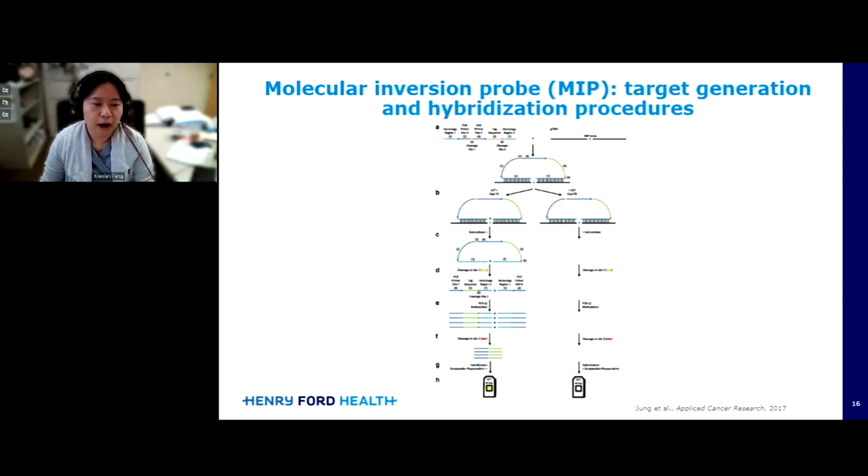All right. So the OncoScan microarray, which we'll talk about today, has incorporated the technique called molecular inversion probe, MIP technology, to generate targets, which hybridize to probes on the OncoScan platform. The genomic DNA is hybridized for 16 to 18 hours with CNV and somatic mutation probe mixes, which is represented here. And it's recommended by the manufacturer to use 80 nanograms of genomic DNA. But in published literature, some labs suggested that as little as 30 nanograms could be used from FFPE extracted genomic DNA.